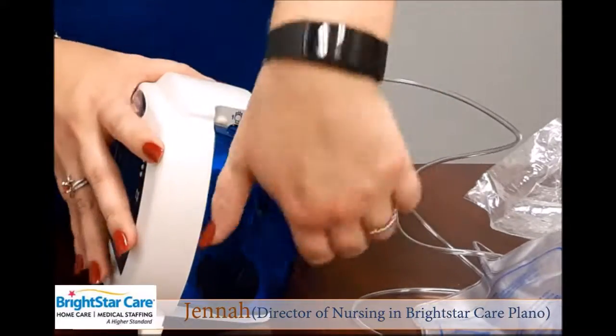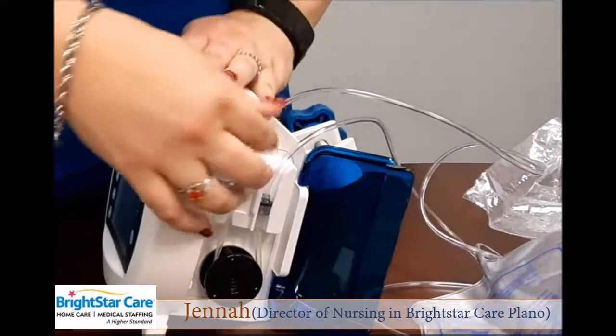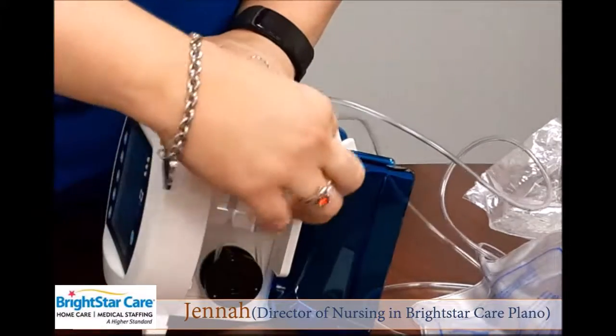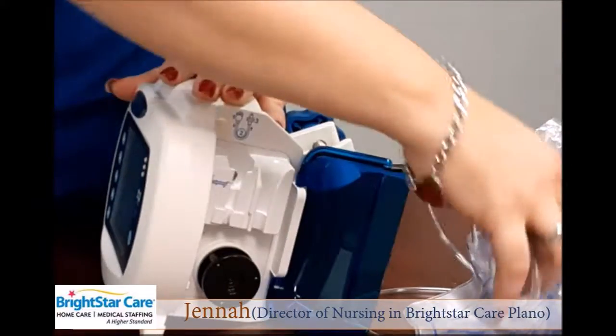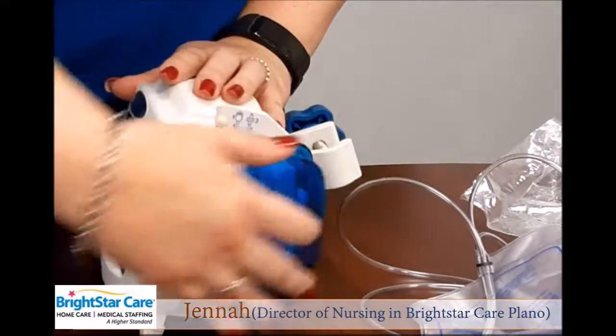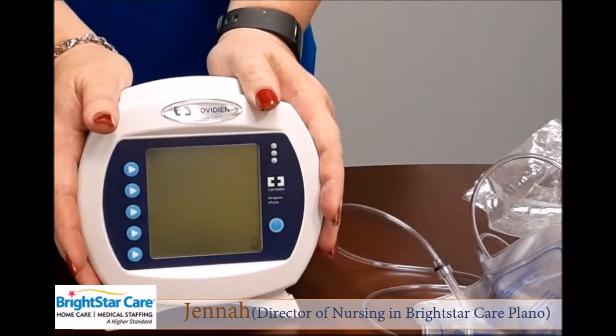You can turn to the side screen, open your door, and instead of 1, 2, 3, now we're going to go 3, 2, and 1. Removing our set, closing our door, and having our pump ready for our next feeding session.